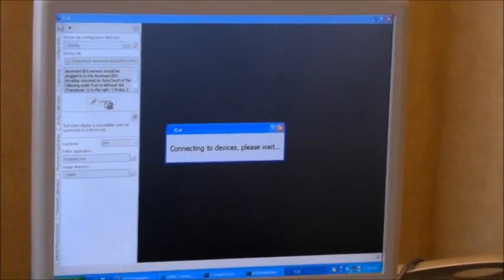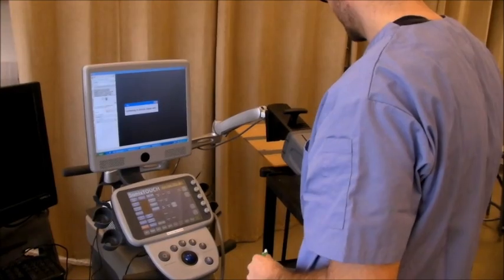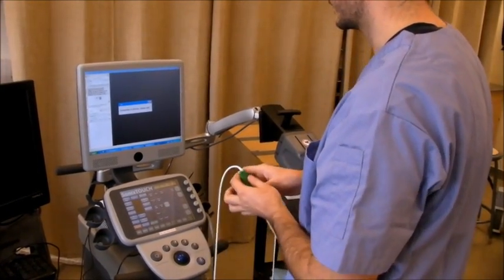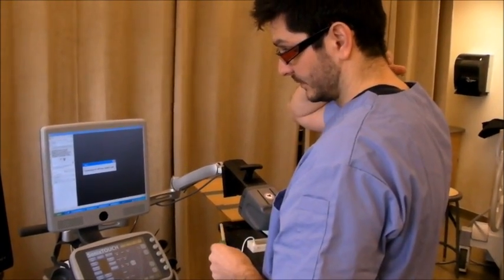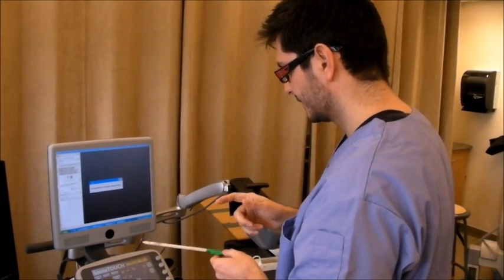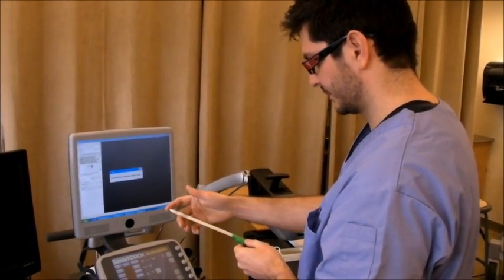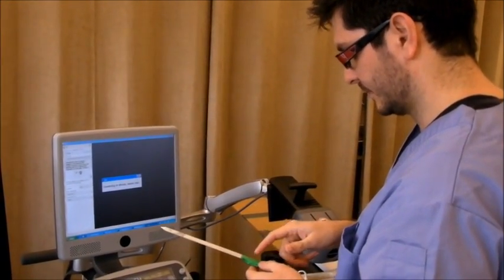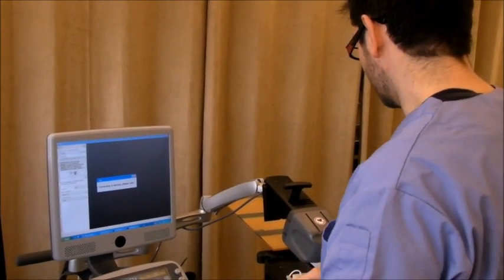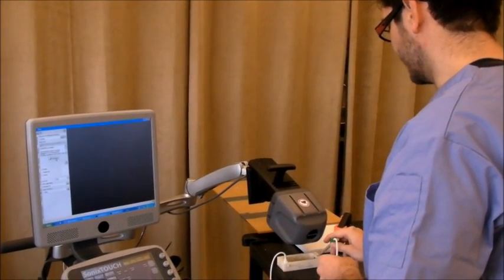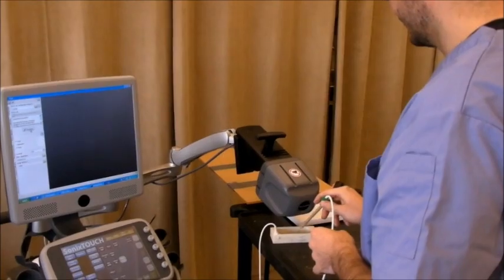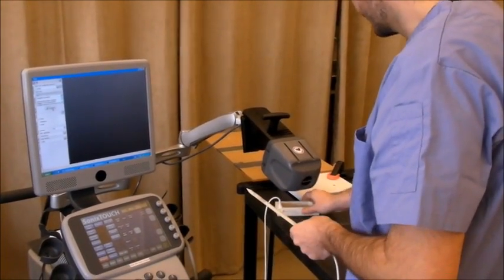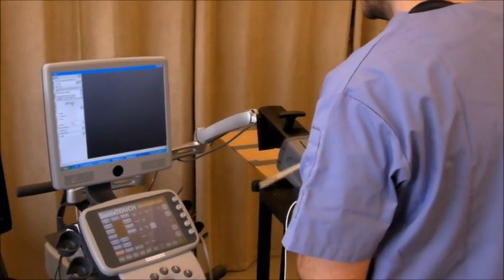Now I'm connecting to the device set. The calibration consists of three steps. First, we have to calibrate the stylus, determine the stylus tip position in relation to the sensor. Then we're going to calibrate the Phantom itself, and then the image to probe.